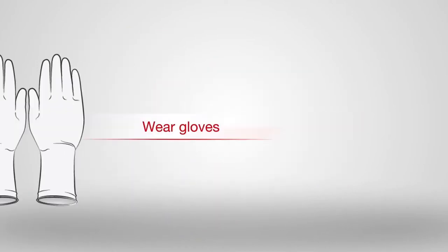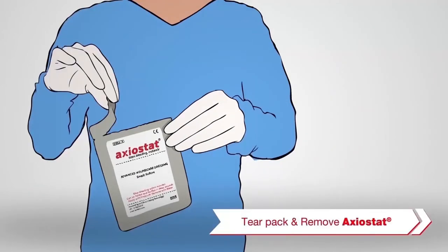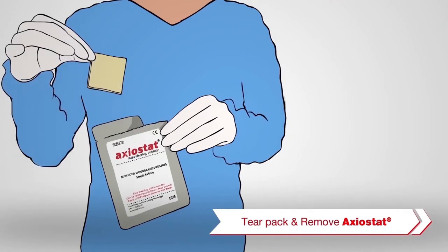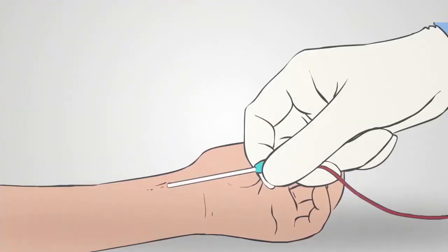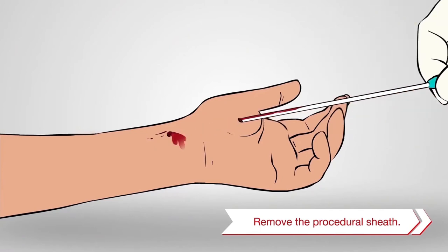Using clean, gloved hands, tear open the sterile single-use pack and remove Axiostat. Remove the procedural sheath carefully.